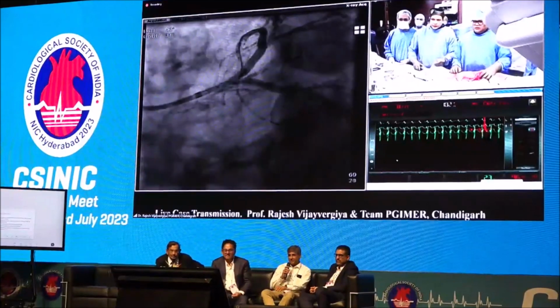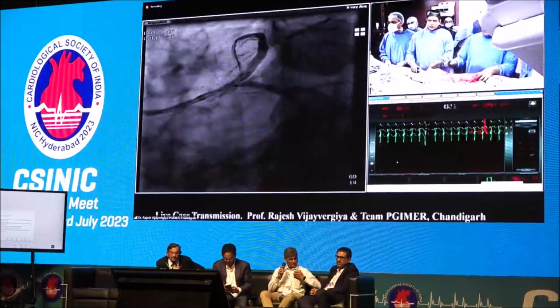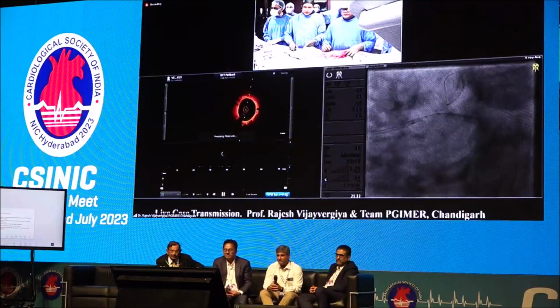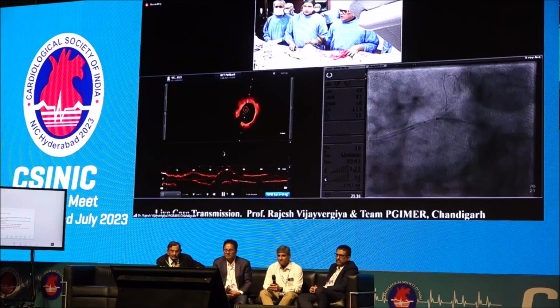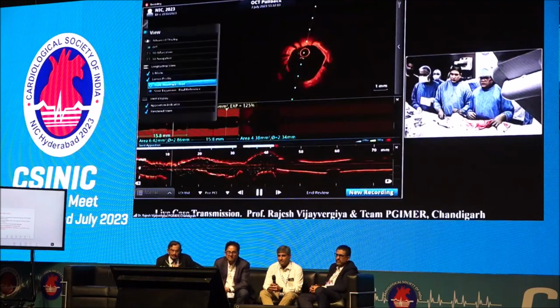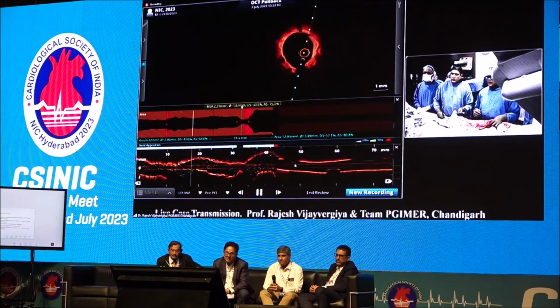I think you're planning for a TAP. Okay, so we have done the OCT. Can you show the OCT then, please? First for the LCX. This should be interesting. Can you have a big screen for the OCT?